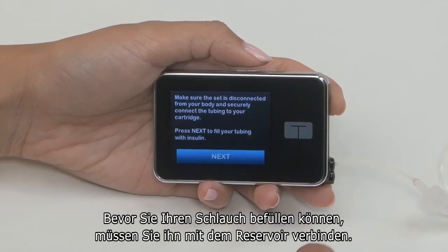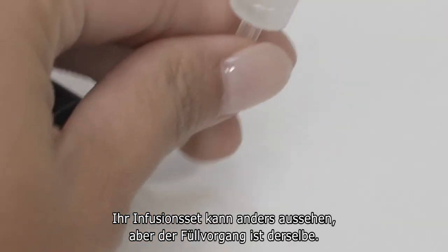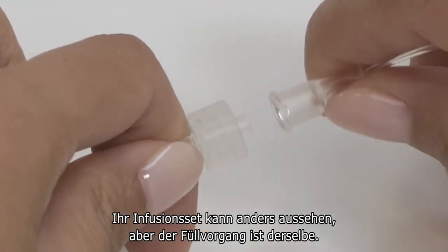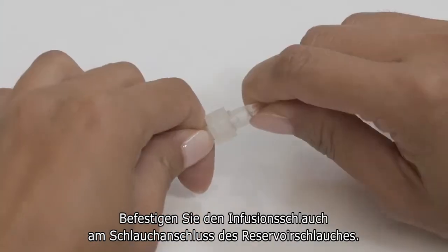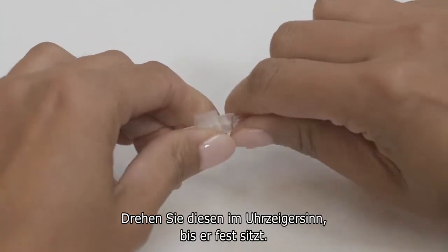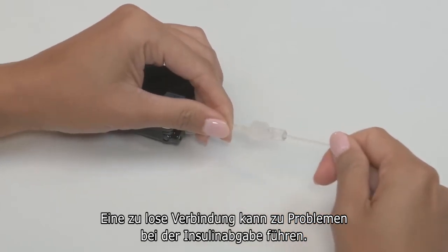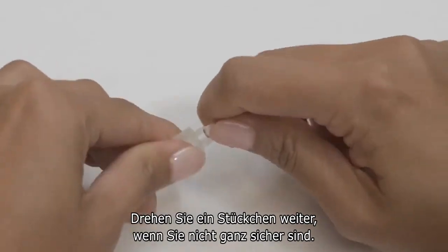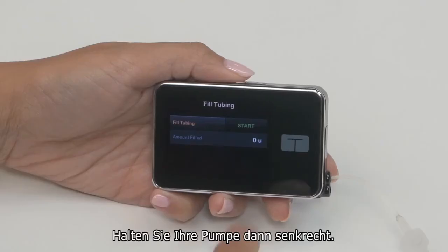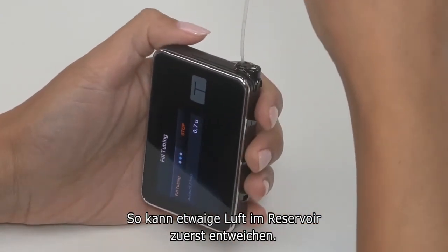Before you can fill your tubing, you need to connect your tubing to the cartridge. Your infusion set may look different but the tubing fill process is the same. Insert this end into the tubing lock connector on your cartridge and twist clockwise. Make sure it's nice and tight — a loose connection can lead to delivery problems, so it's always a good idea to double check, and when in doubt give it an extra twist. Next, turn your pump so it's vertical; this allows any residual air left in your cartridge to be pumped out first.